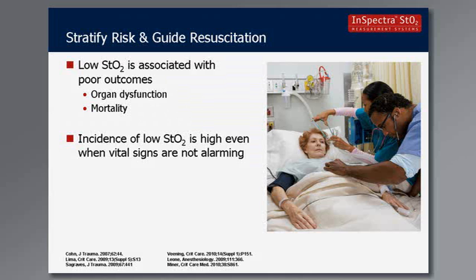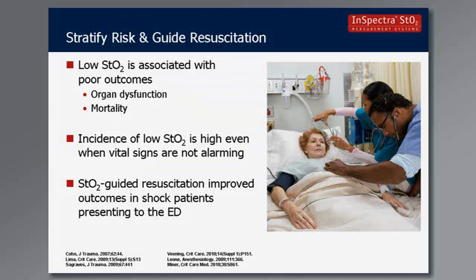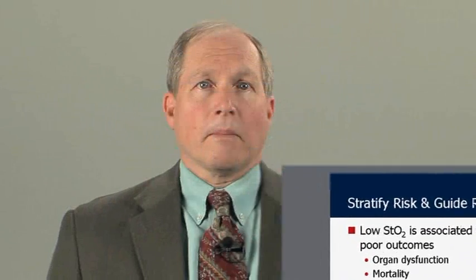In the Netherlands, Venning measured StO2 in ICU patients considered to be resuscitated, and yet found a similar incidence of low StO2 readings. Importantly, a study of patients presenting to the emergency department in shock demonstrated that StO2-guided resuscitation resulted in a shorter hospital length of stay.